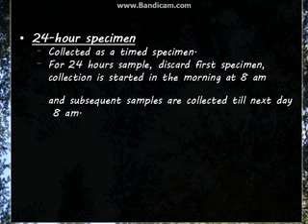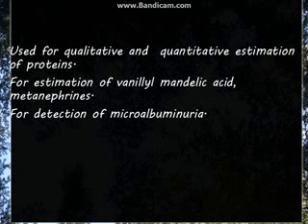sample was discarded. Now this specimen is used for quantitative estimation of proteins, for estimation of VMA and metanephrines in the case of pheochromocytoma, and for detection of microalbuminuria to assess renal damage, the early stages of renal damage.